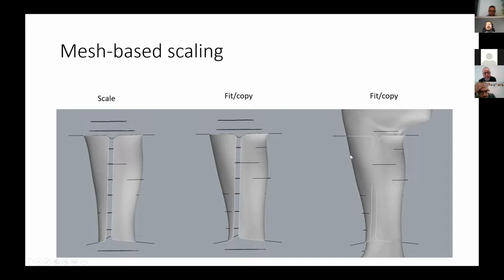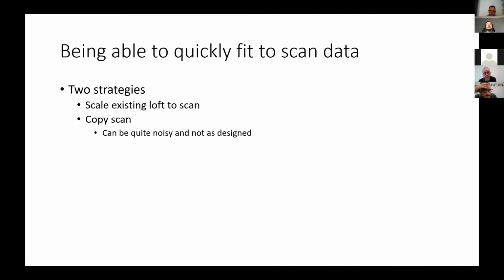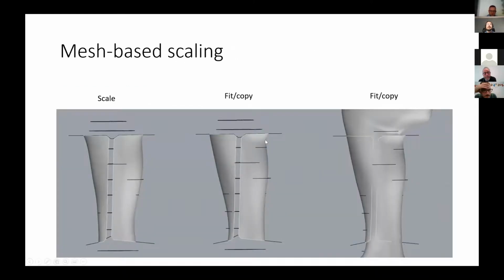And while using a leg scan like this might seem obvious and useful, it turns out that using the leg scan as a basis doesn't always generate that nice of a look. It doesn't look that natural and doesn't look especially aesthetically pleasing in all cases when we just replicate the leg scan. So often it's better to do scaling and to add some sort of manual design work to it to get a more industrial design look to the final product.